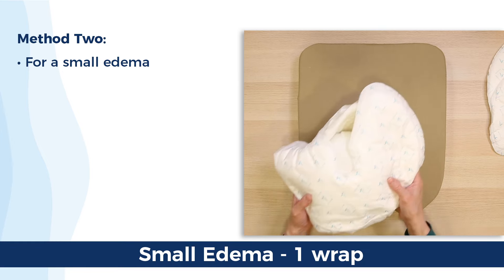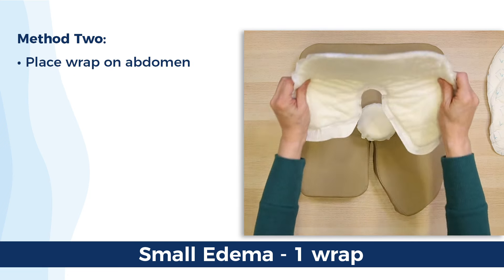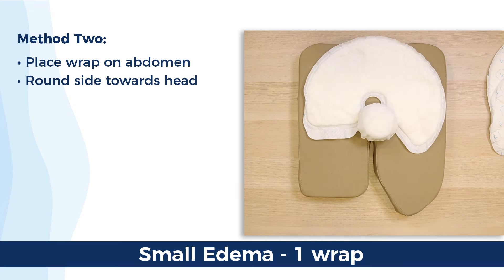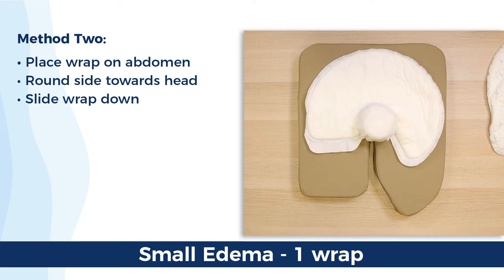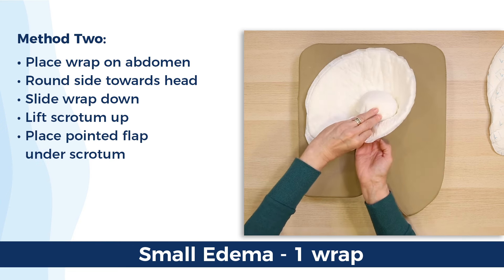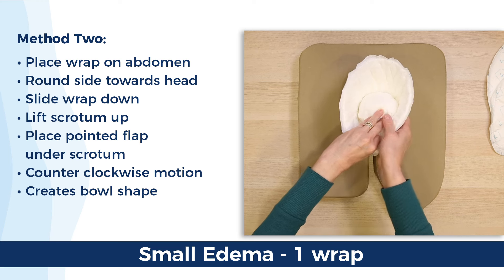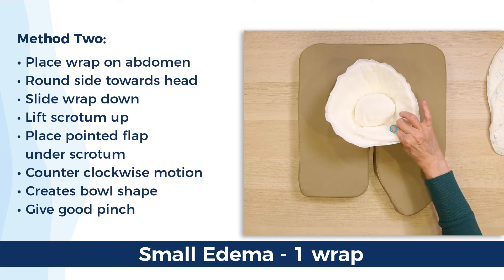Make sure to give it a good pinch. If the edema is closer to the size of an orange, only one wrap is required. Place the wrap on the abdomen with the white absorbent side up, with the round edge towards the head of the body and the two flaps towards the legs — legs to legs. Slide the wrap down so that the inner ring is as low towards the base of the shaft as possible, or if totally retracted, the tip of the penis. Gently lift the scrotum up, separating it from the legs. Using the pointed side as a lever, place it under the scrotum, then fold the second side over, slightly pulling upwards. Make sure there's a snug, semi-tight fit at the base of the genitals to prevent possible leakage, then pinch the hook fastener and inner flap together to get good adhesion.